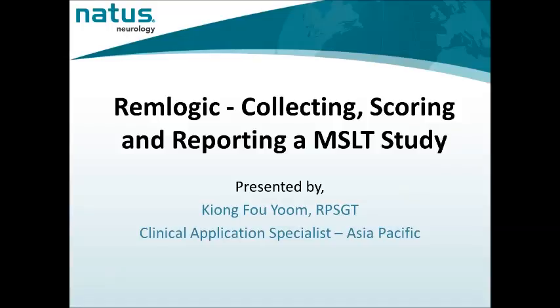Thank you for taking time to join my webinar session today on RemLogic collecting, scoring and reporting a MSLT study.